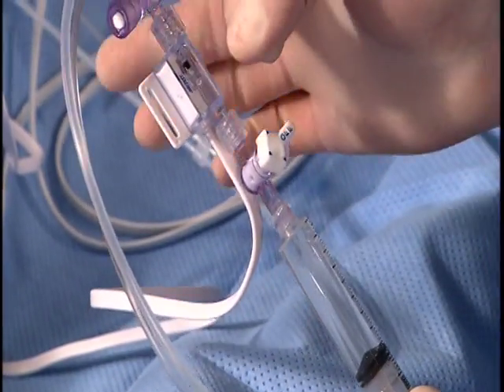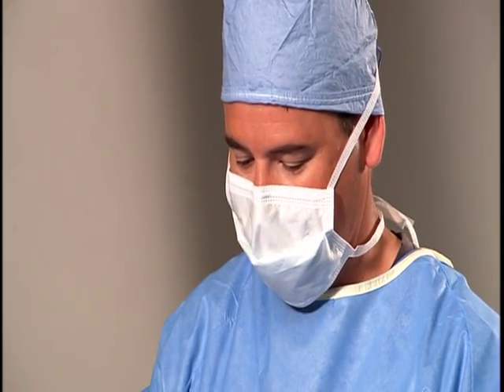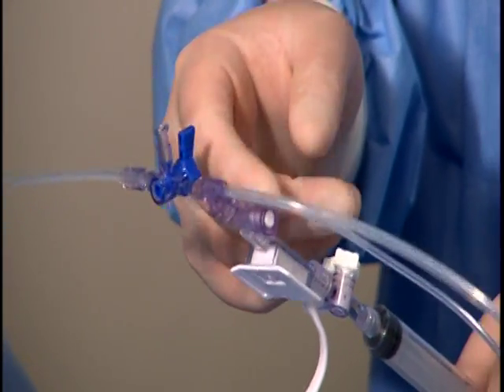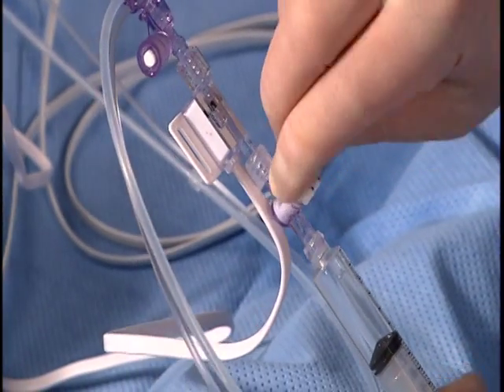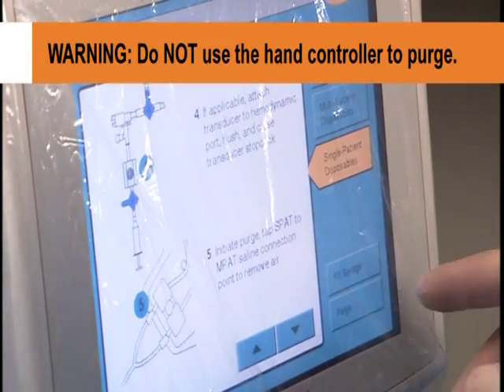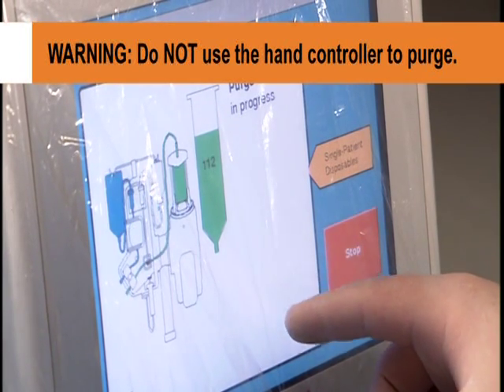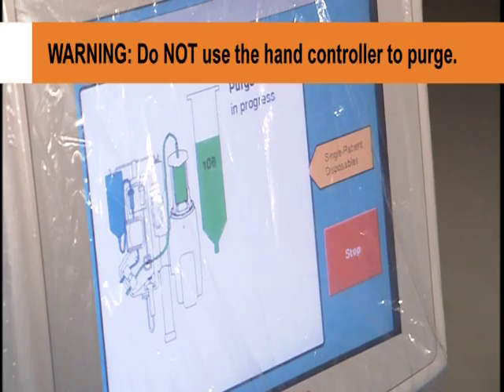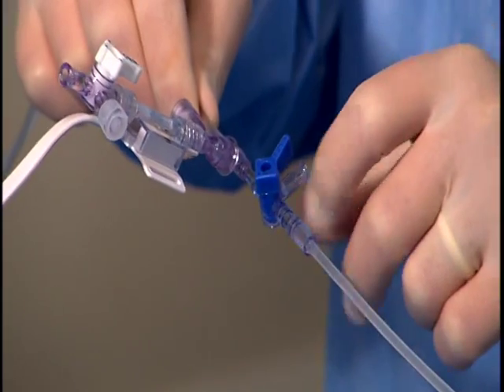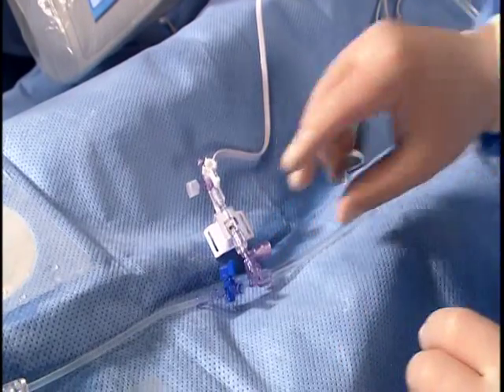Then, forcefully flush saline through the transducer and PIV assembly until air is expelled from both components. Flick or tap the PIV to facilitate air removal, and repeat as necessary. Close the transducer port stopcock and remove the 10 cc syringe. In the setup screen, touch Purge. Initiate a simultaneous contrast and saline purge by touching the Purge button. Flick the SPAT to MPAT saline connection point and waste port stopcock to remove air while purging is in progress. Repeat as needed until all air is removed.